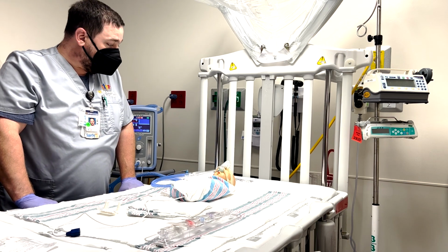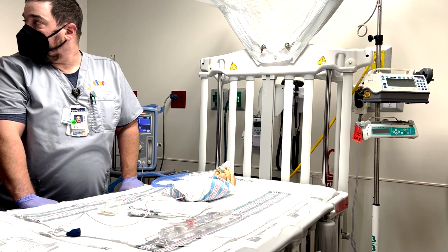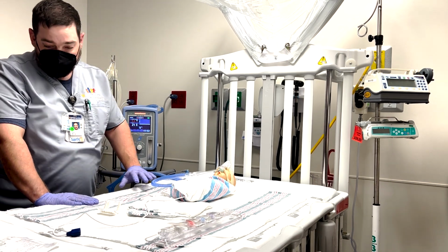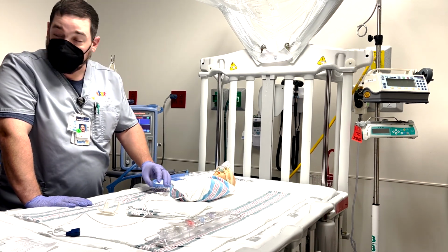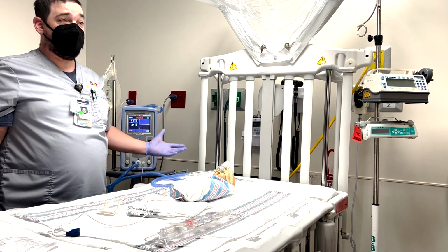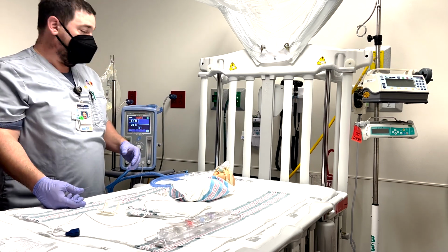I don't know if you've spent any time in the NICU, but skin breakdown is just a constant battle. One of the things that has helped me, and I know that it irritates a lot of NICU nurses, not just the children, is I usually alternate between prongs and mask every 3 hours. But I'm also a day shifter, and the baby's going to be awake more during the day, so it's easier for me to get away with that.